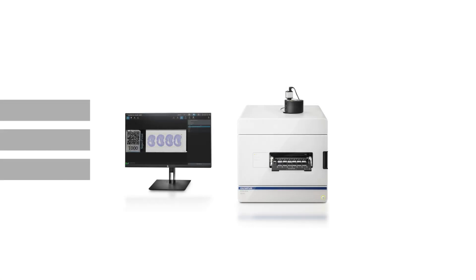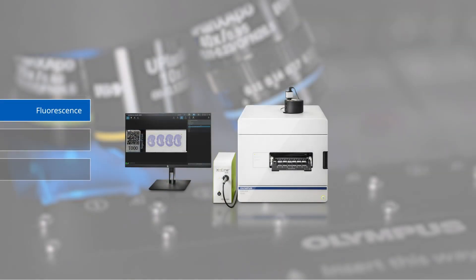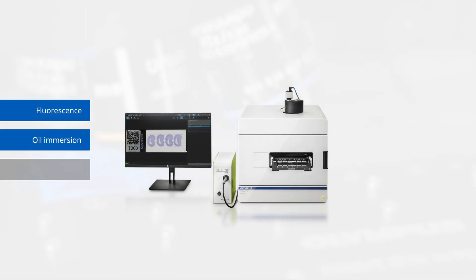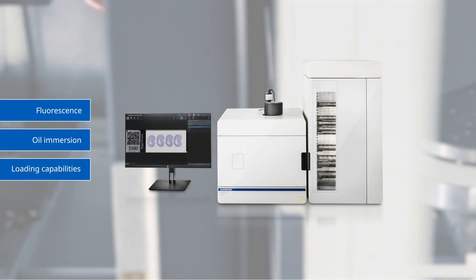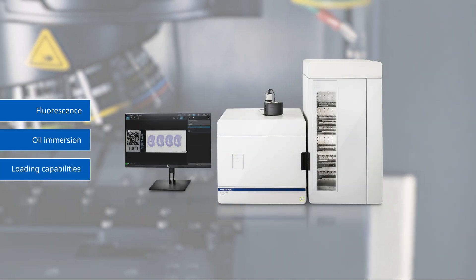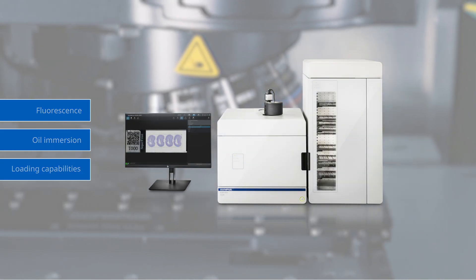The system is also flexible enough to grow with your work. You can add fluorescence, oil immersion, and automated loading capabilities to your system as your needs change.